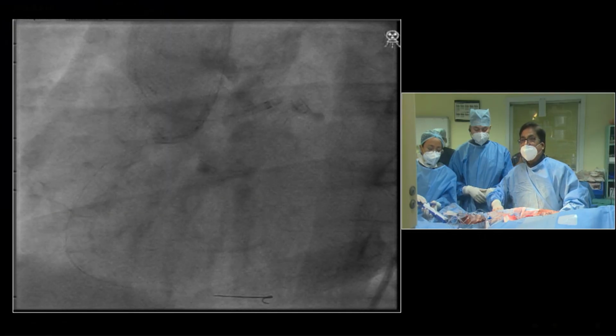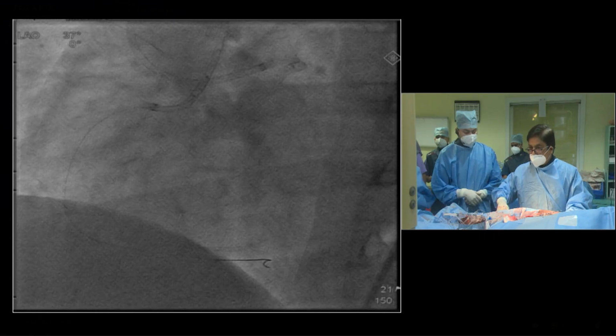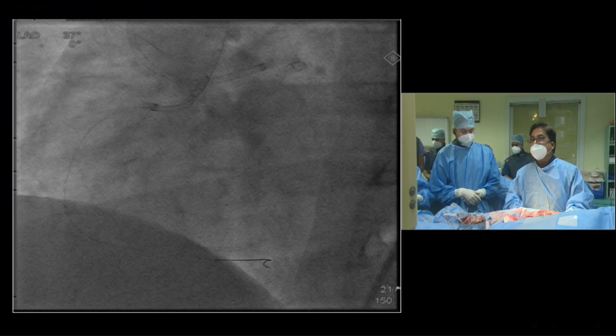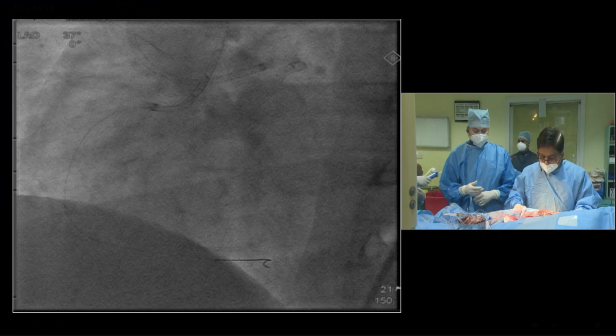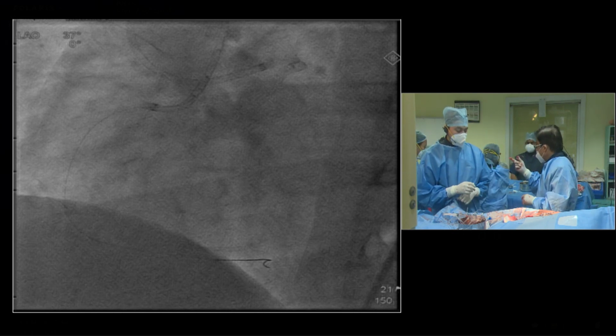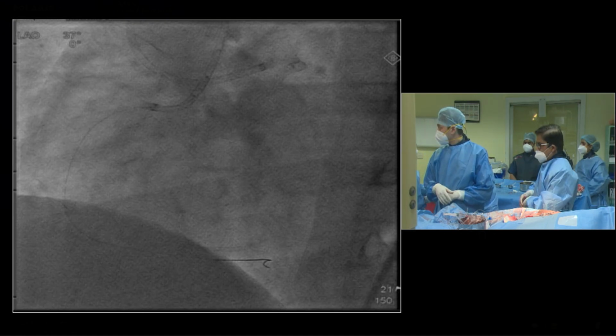One statement is, you see what you know, and the second is seeing is believing. Okay, just for a hypothetical case, Pratap, if Dr. Goel, God forbid, did not do it antegradely and had to go to a retrograde approach with a 1.2 or 1.5 millimeter long balloon, how would your assessment of your retrograde channels be in this case?